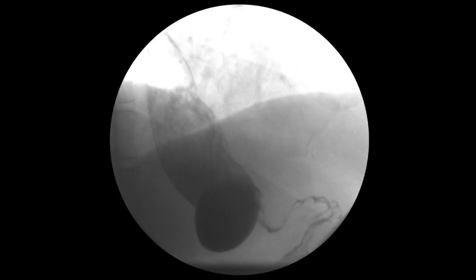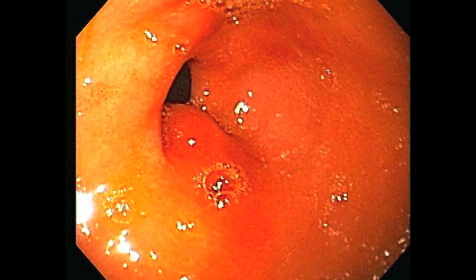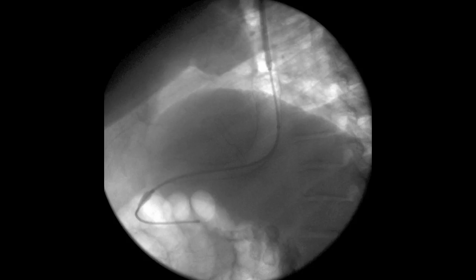Endoscopy confirmed the stenosis, which was traversed with gentle pressure while twisting the scope to the right. The remaining sleeve was otherwise patent down to the pylorus. A 12.5 centimeter by 23 millimeter covered stent was placed with a paperclip marking the stenosis. Almost immediately, the stent was displaced upward into the esophagus.